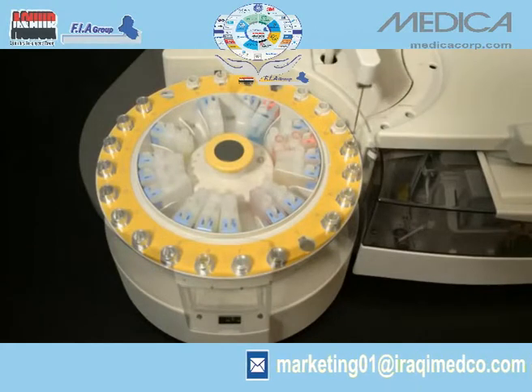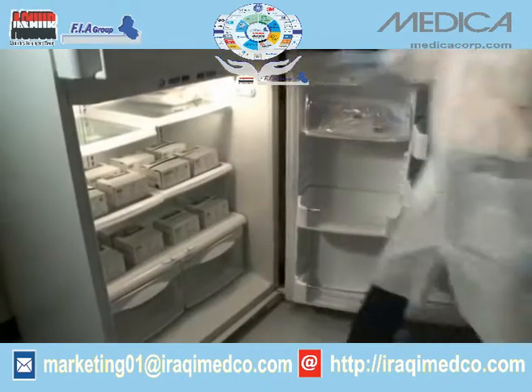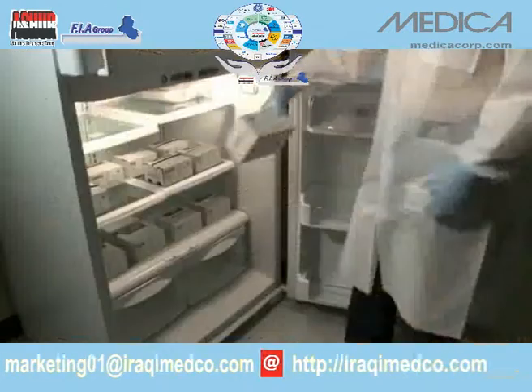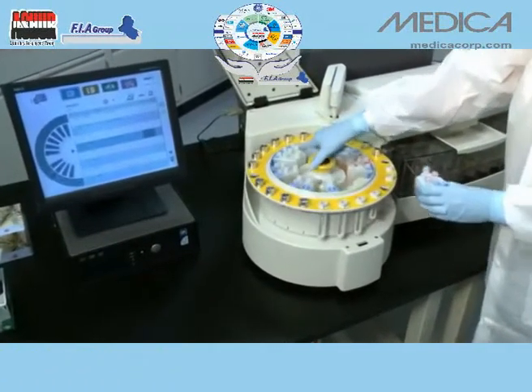low reagent usage for every test, and low service costs even with as little as 20 samples per day. Our reagents are liquid, stable, and ready to use. EZRA automatically performs reagent parameter setup — reagent setup is fast, easy, and error-free.